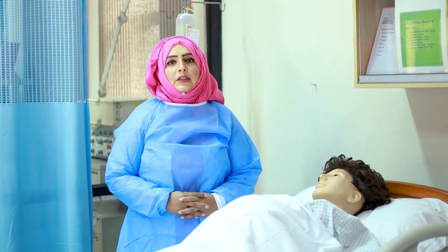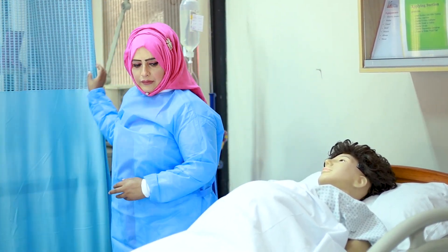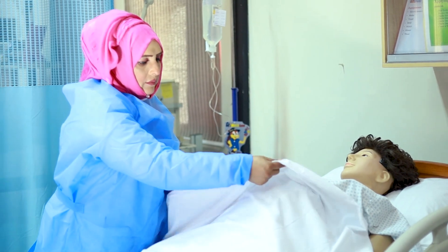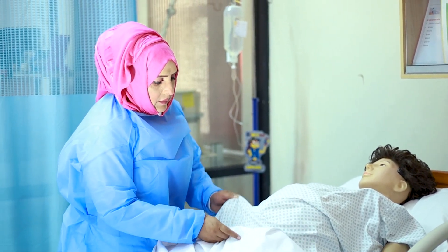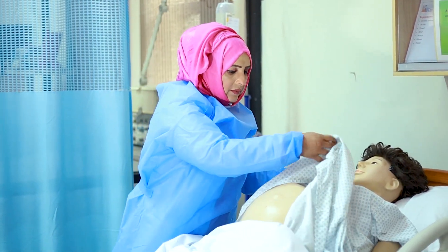Please provide privacy and expose the patient.